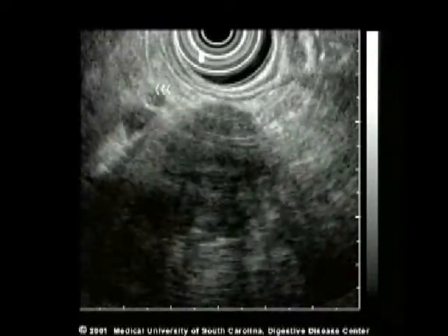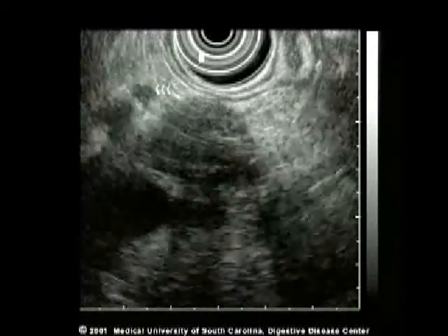A small, benign-appearing lymph node is seen above and to the left. Note its irregular shape, fuzzy margins, and size is less than one centimeter.